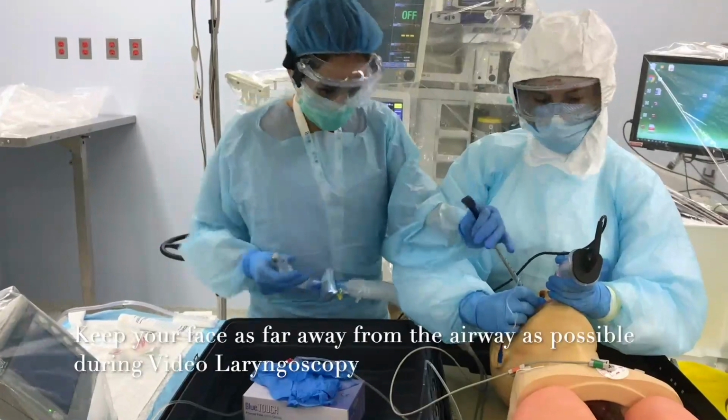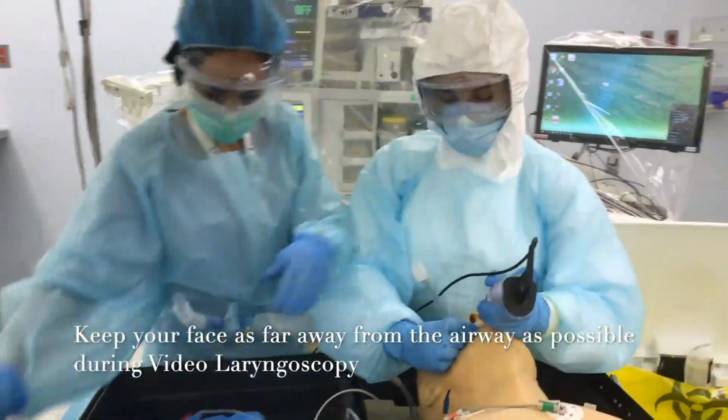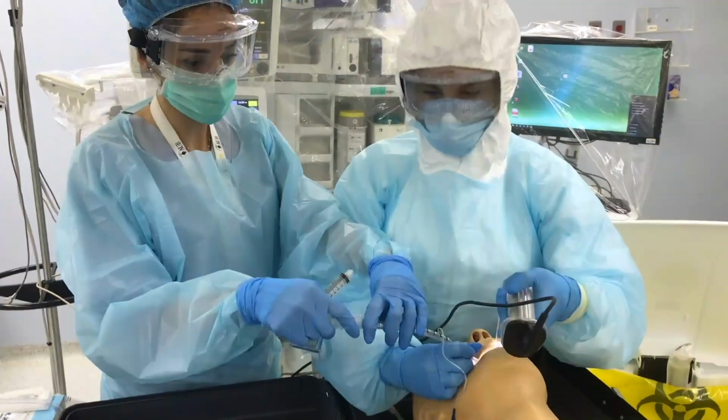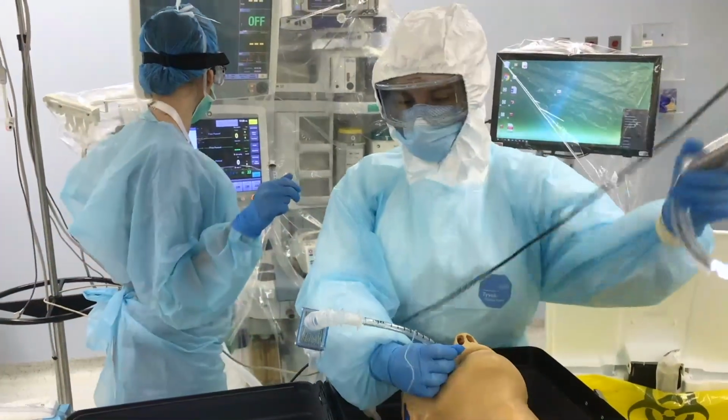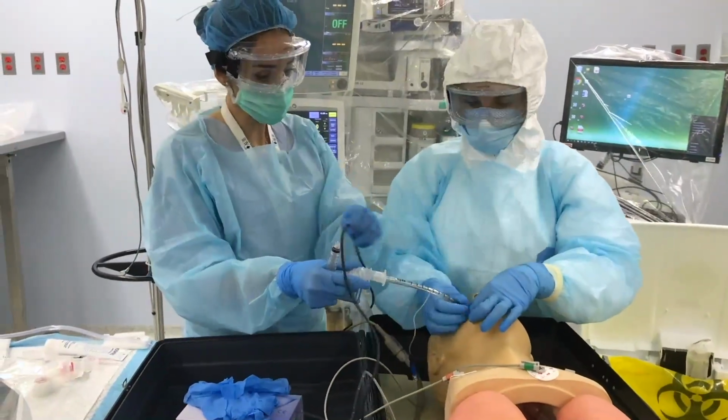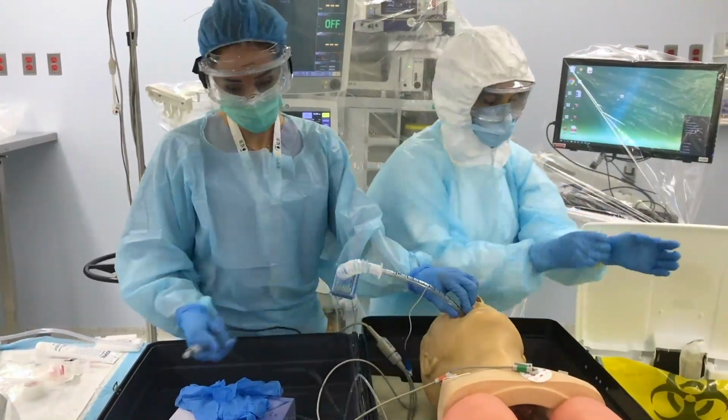Tube is in. Okay, so I'm going to take your stylet out. We'll put it in the disposal bin. We'll inflate the cuff and we'll connect the tube. Gas flow is going to be resumed. You have it inflated, so your tube is in. You might remove your first set of gloves and replace them while I tape the tube.